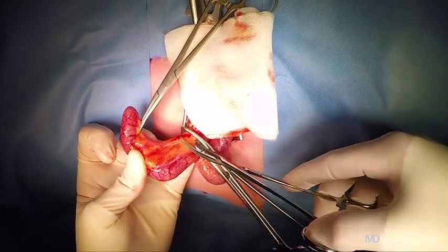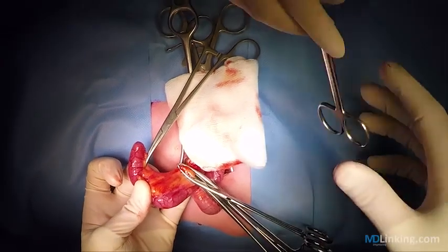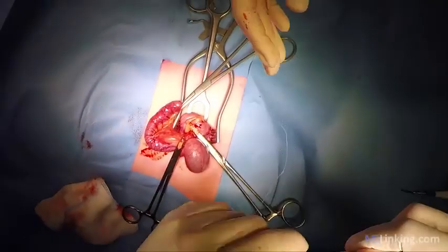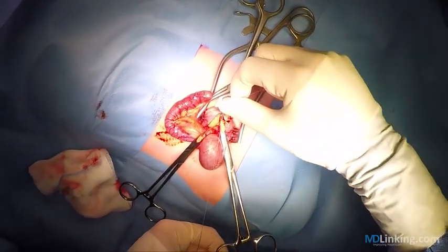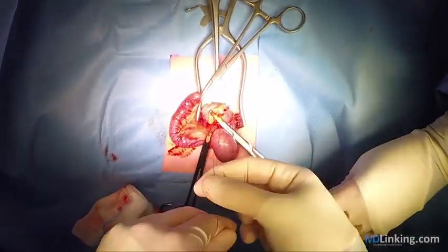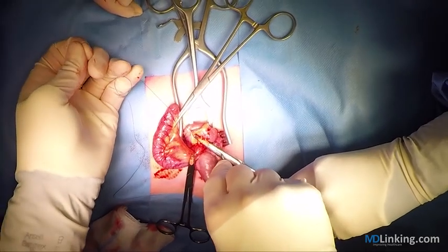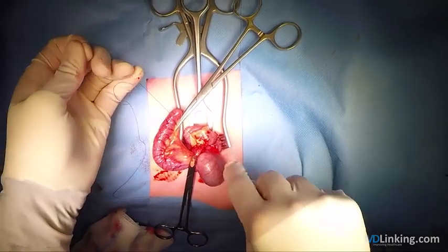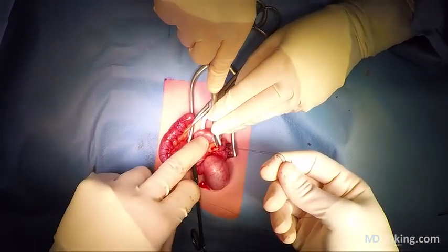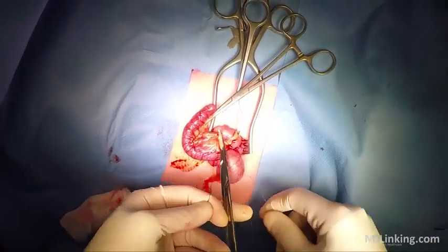It's also possible to divide the mesoappendix from the appendix itself with multiple steps and just following the mesoappendix along the appendix itself, but it will take multiple steps, and if it's not too thick you can be done with just one ligation, if you selectively ligate it at the base.